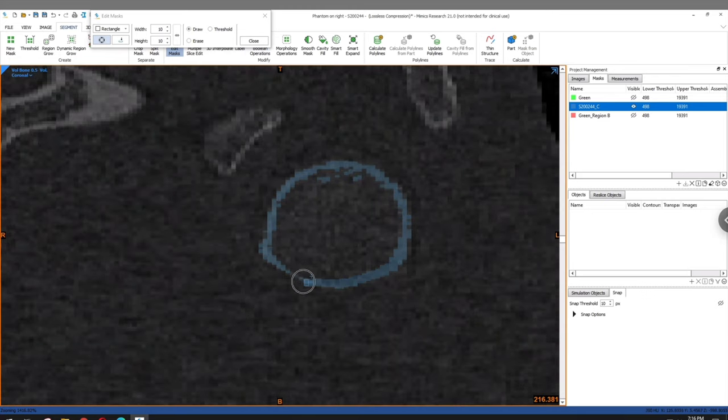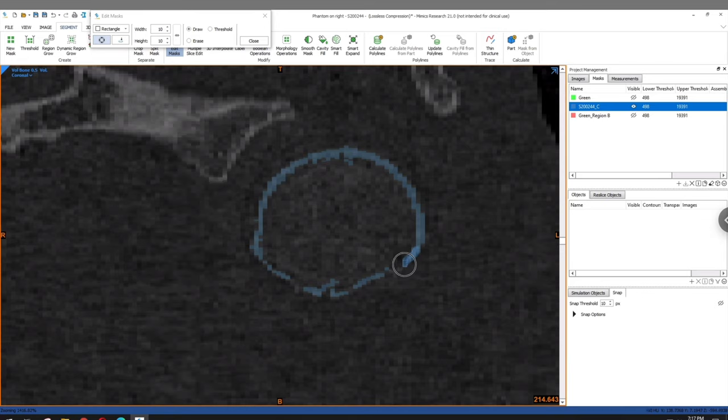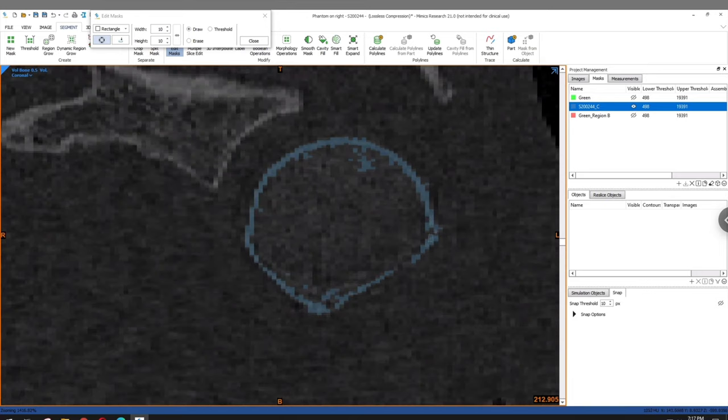There is a native function in Mimics itself called 3D interpolate, but I would actually suggest you avoid using this feature, as sometimes it overestimates the thickness of the shell itself, or sometimes it just won't work entirely if your voids are too large. So in this particular case, my best suggestion is actually to go, and as you can see I'm doing here, individually at each segmented CT slice, you really need to individually go and complete the image as best you can.